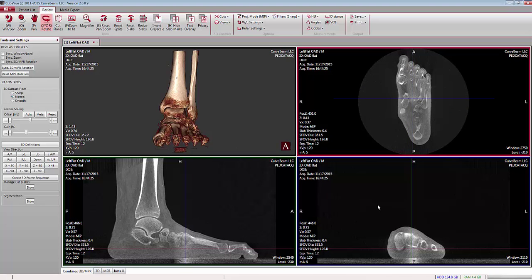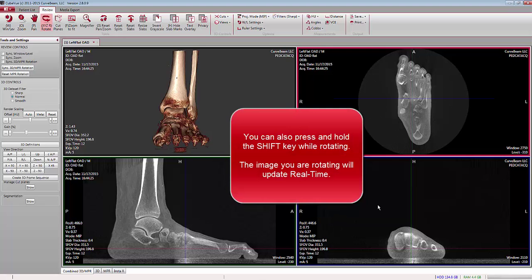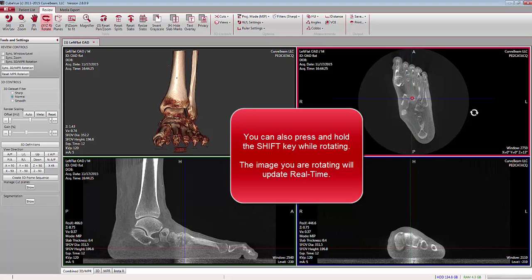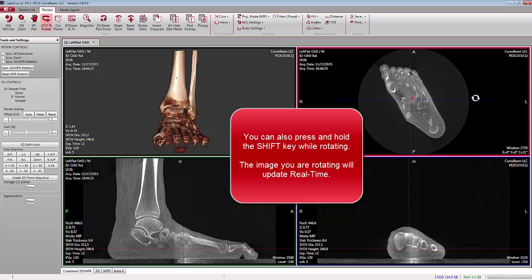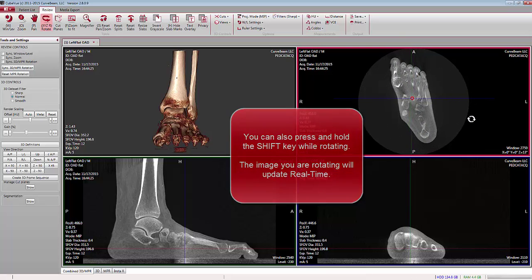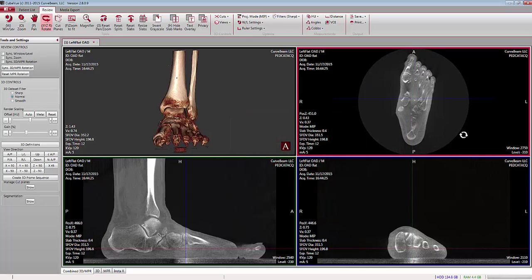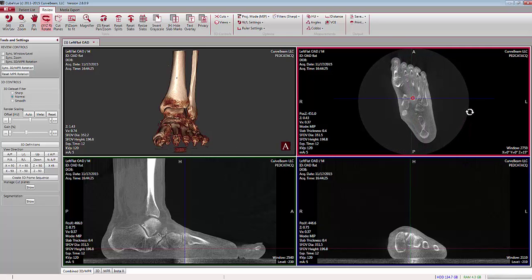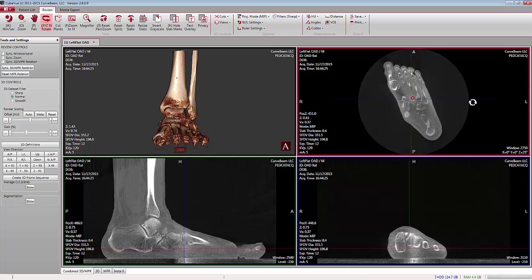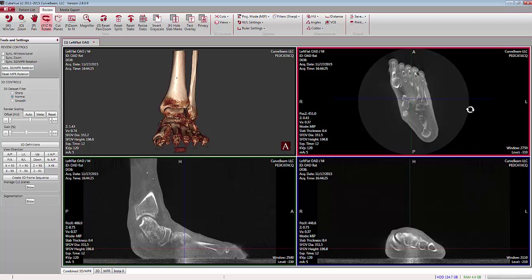There are two other options available for rotating in the NPR views without involving the 3D volume. One is to press and hold the Shift key at the same time that you drag with your left mouse click. Notice the actual view updates in real time. When you let go, all of the other views will catch up. Again, press and hold the Shift key, left-click and drag at the same time; when you let go, all of the views catch up.